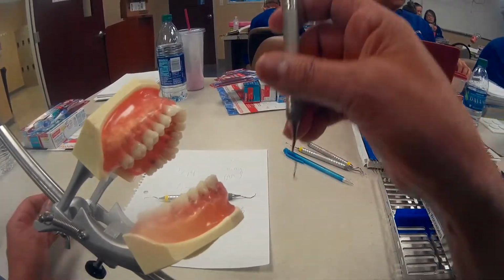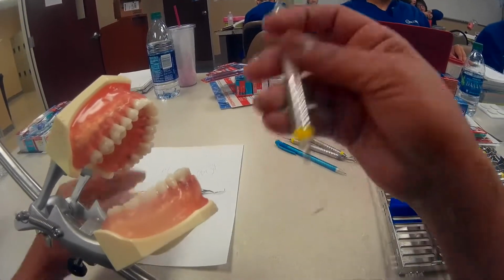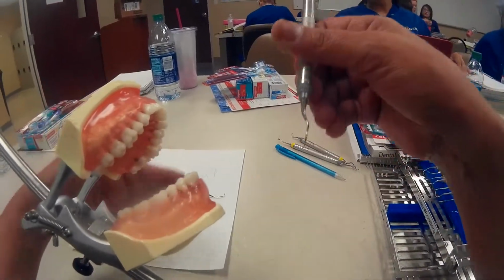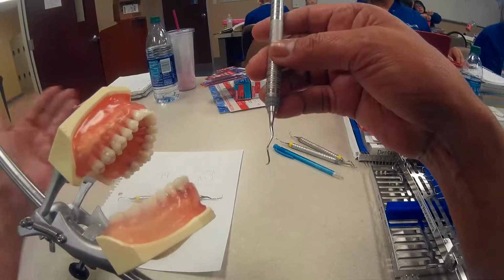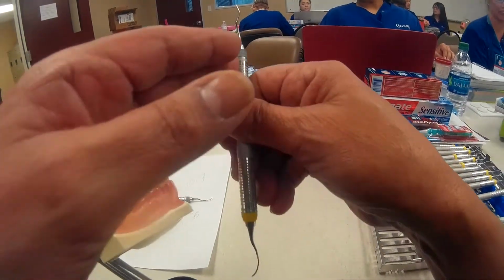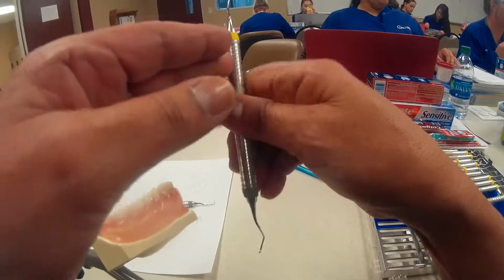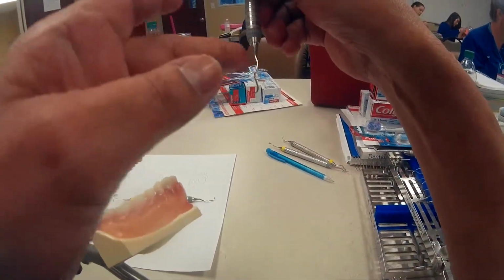All right. Is this my mesial end or is this my distal end? So, again, knowing what we've known and what I've been trying to get you guys to remember, the more sharp the bends, that's going to be your distal end. Okay, so there's a bend there, and I see that end, and then there's this. So compare this to this. This is my distal end.